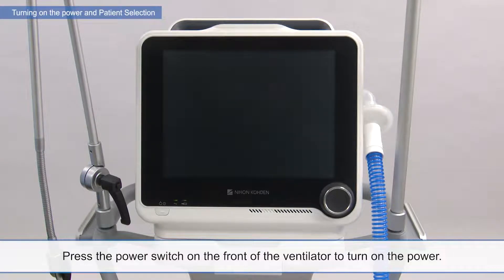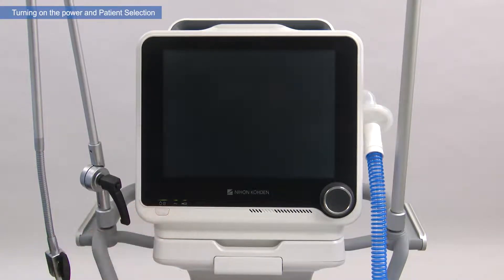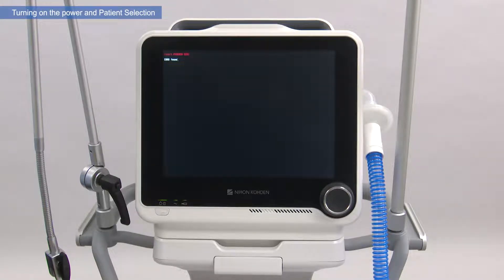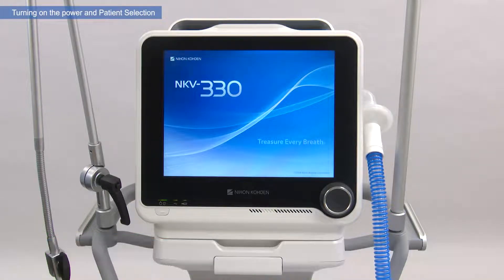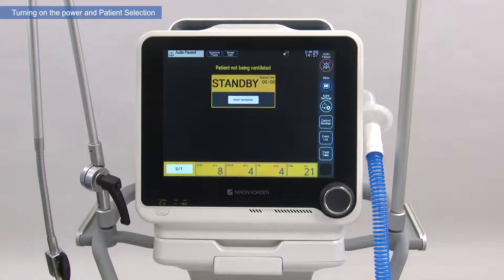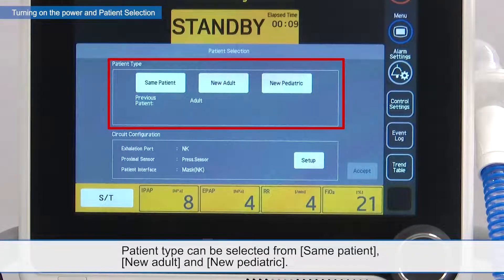Press the power switch on the front of the ventilator to turn on the power. Make sure that the patient selection window appears after the start-up screen. Before starting ventilation, select the patient type on the patient selection window. Patient type can be selected from same patient, new adult, and new pediatric.